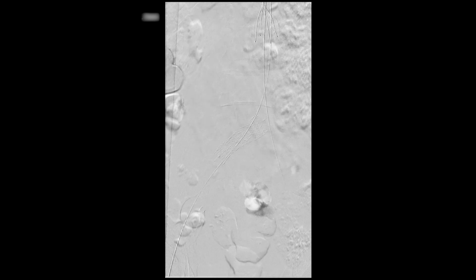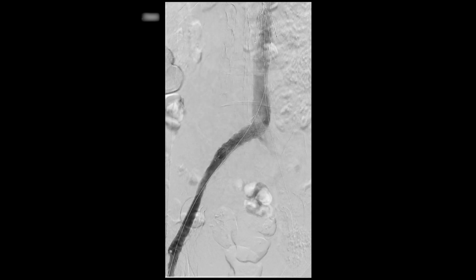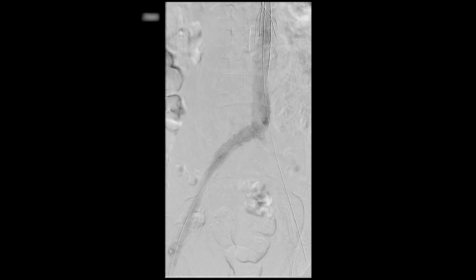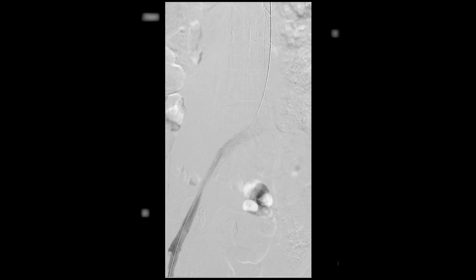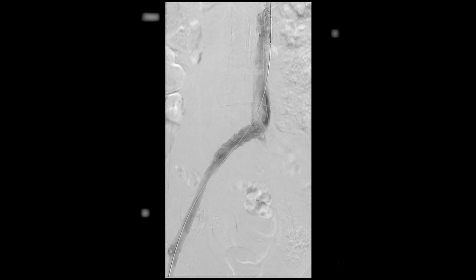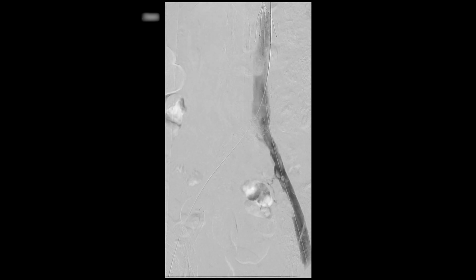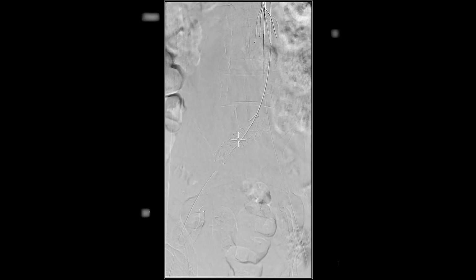After placing our stent, we then performed our final venograms, first from our left side. This demonstrated good flow out of the left lower extremity into the inferior vena cava. I wasn't particularly happy with the positioning of our stent, as it did encroach upon the confluence more than we had intended, but there was brisk flow getting through the stent, as exemplified by the negative on this image. We then repeated our injection from the right side, and this demonstrated good flow through the stent and out of the right lower extremity. Happy with this, we concluded our procedure.